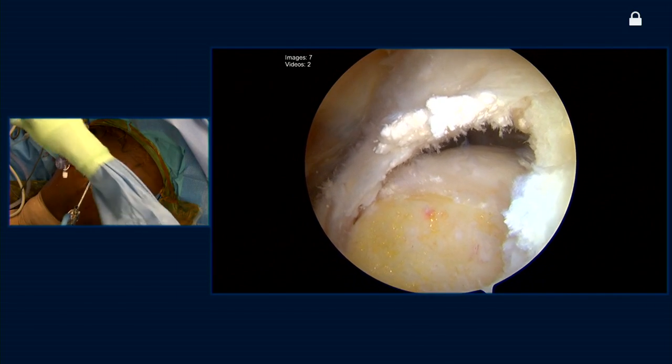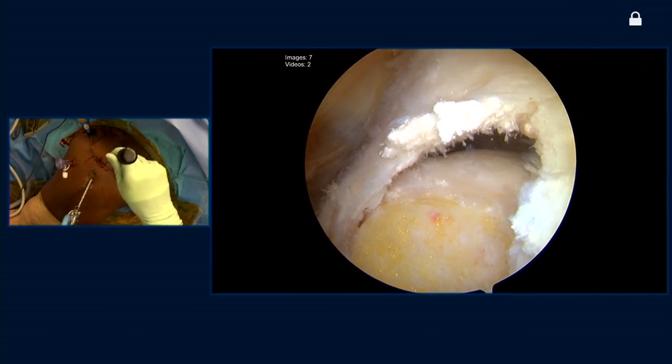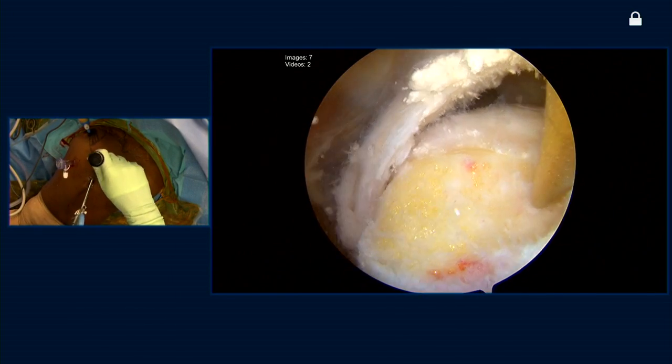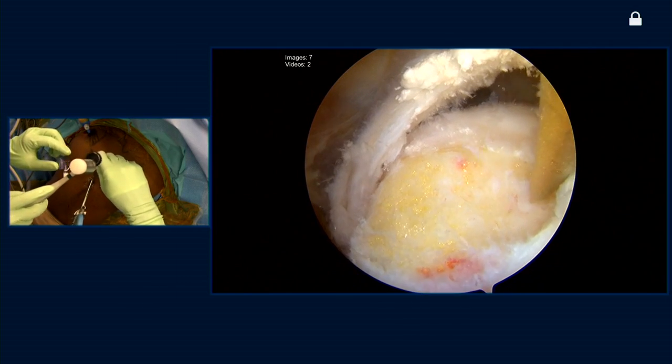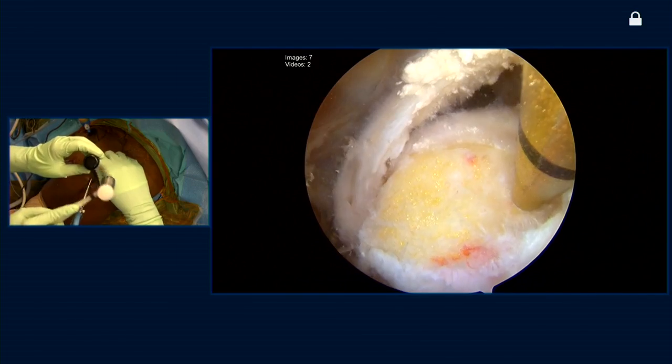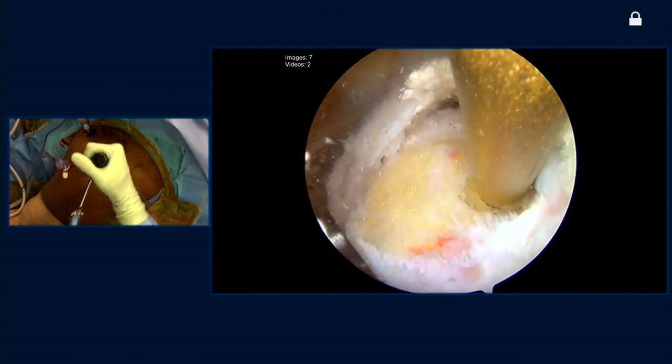I'm going to just make a stab wound for percutaneous placement. We're going to come just off the edge of the articular surface for our medial anchors. We'll prepare our pilot hole posteriorly, and then we're going to prepare our pilot hole anteriorly, just slightly externally rotating the arm at the elbow.